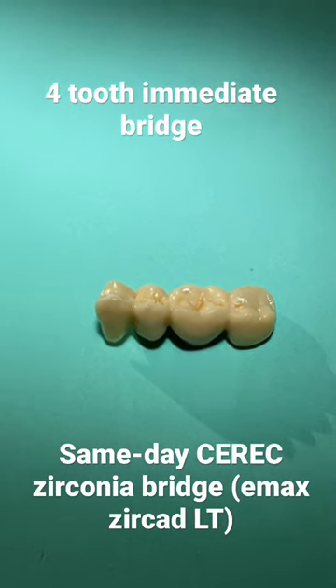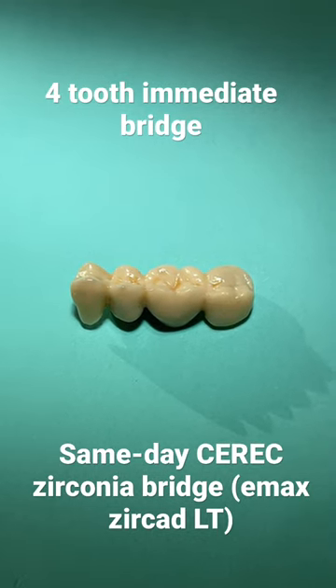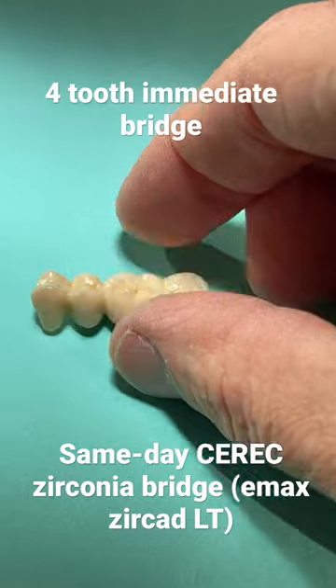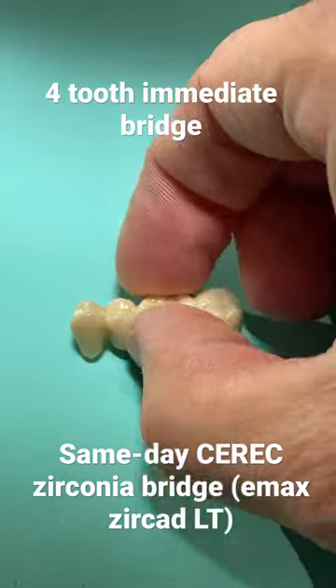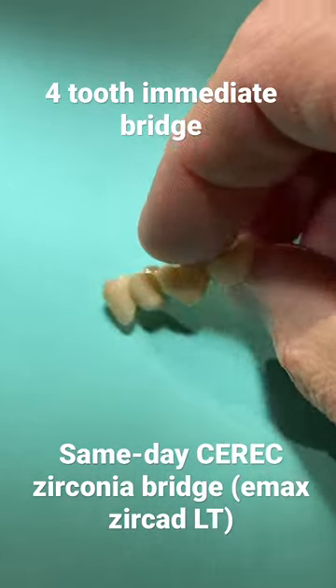Good morning, ladies and gentlemen. Here is the final product of the four-unit Emax Zircad Cerec same-day bridge. You can see some custom staining and glazing on this. I'm not the most perfect stain and glazer, but it looks pretty good.